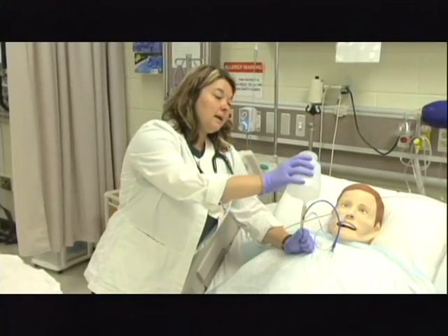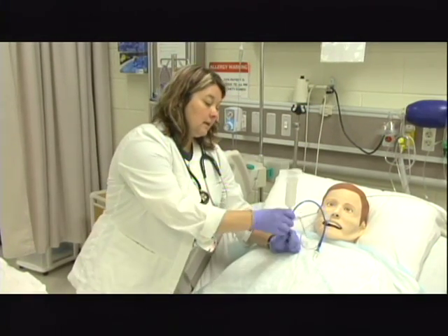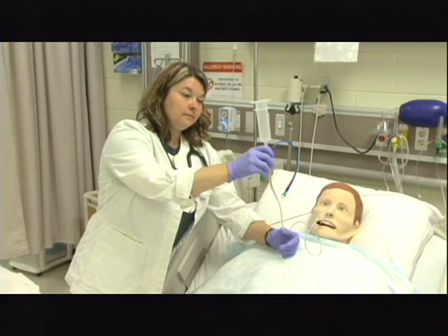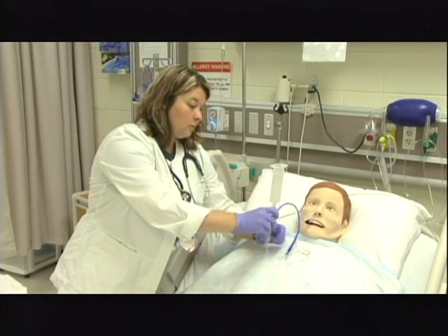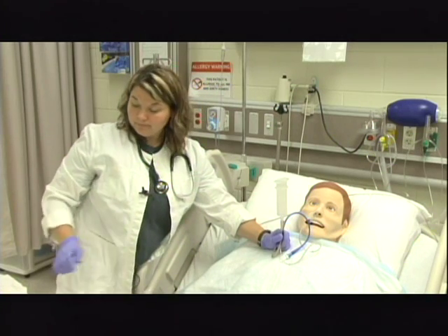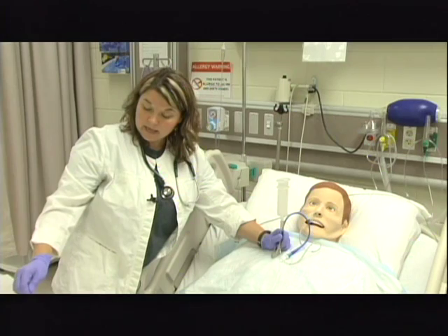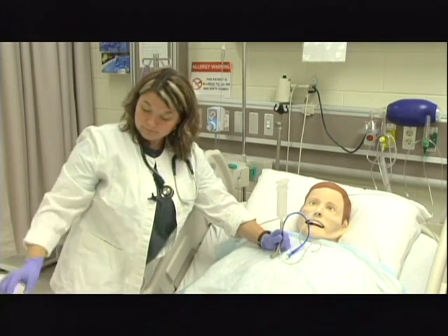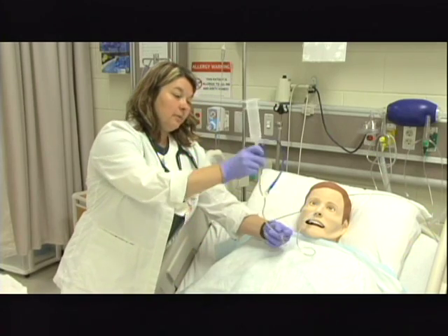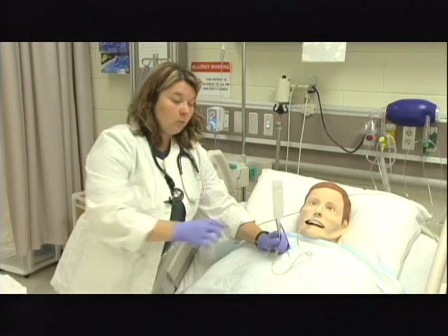Then I need to come back and flush with 10 milliliters of the irrigant. Again, unclamp and let it instill. And I need to reclamp again before all that medication and liquid runs out. I now have my second medication. I would have a new straw that I could agitate it with. I will instill the medication. I'll open up, let it go in by gravity, and before it runs out, I'm going to reclamp it and hold it again.